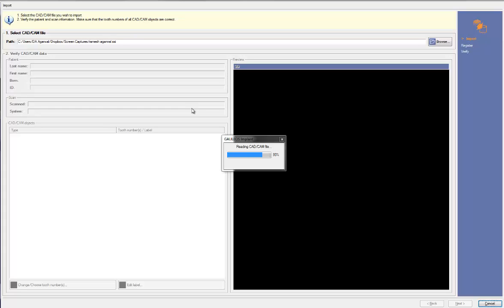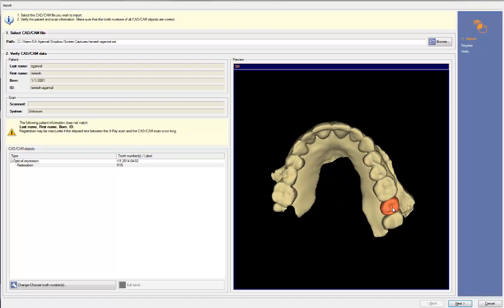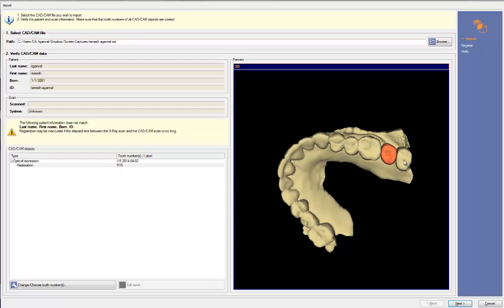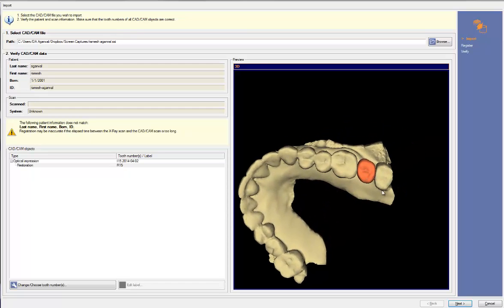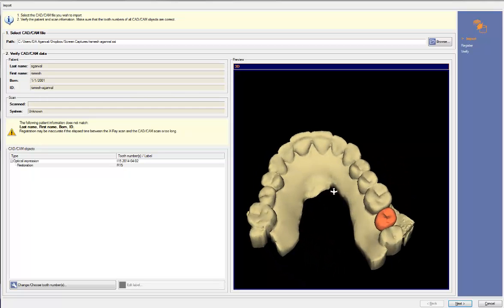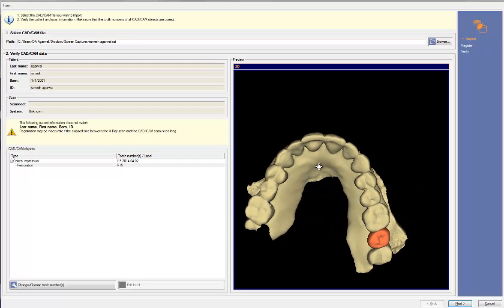So on her, I did a full arch Omnicam scan of tooth number basically 3 all the way over to 15, including some of 16. Since she has 16, I wanted to get some of that tooth so we could have a distal rest right there, and then get cross arch stabilization. So we have a good arch here, good everything ready to move forward.